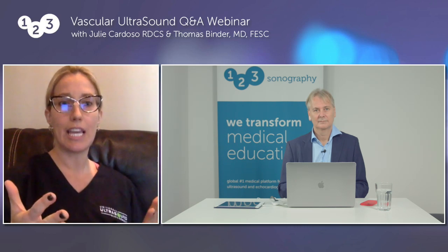Absolutely. So first, when you put your transducer down on the patient, I would start in the transverse view and look at the two vessels on the screen. Usually the veins are double the size of the artery, but that's not always a good indication, because sometimes the patient may have pathology and the veins and the arteries may be the same size. So the first thing you can do is a compression maneuver, and you can see the vein walls coapting. That indicates the vessel is a vein, because the vein walls coapt, and the arteries you can see pulsate at this time.